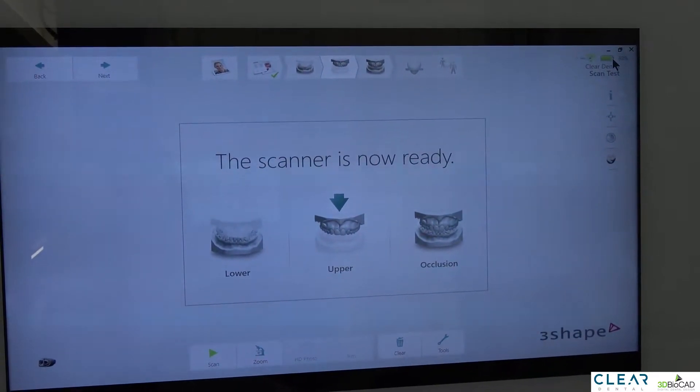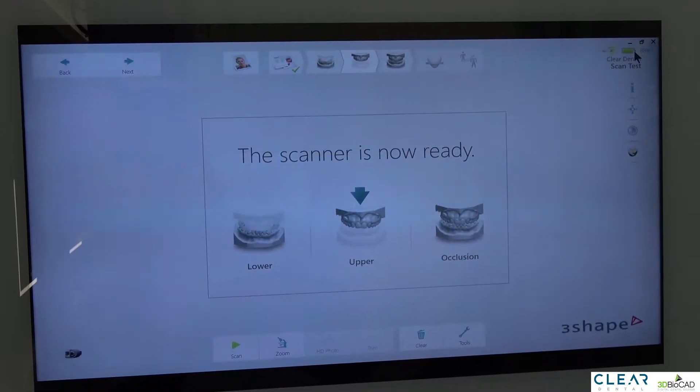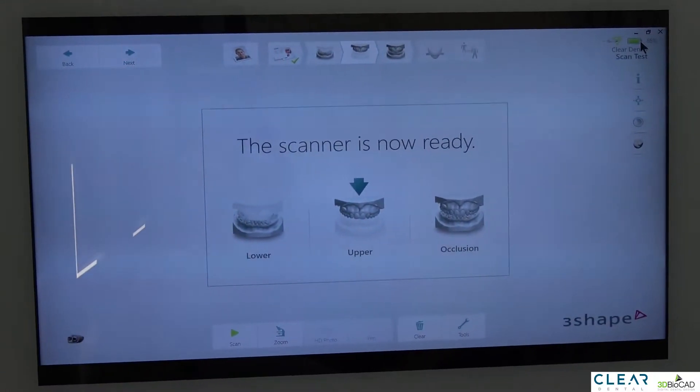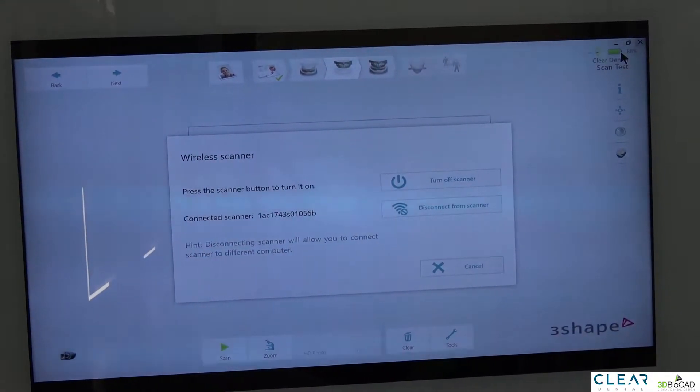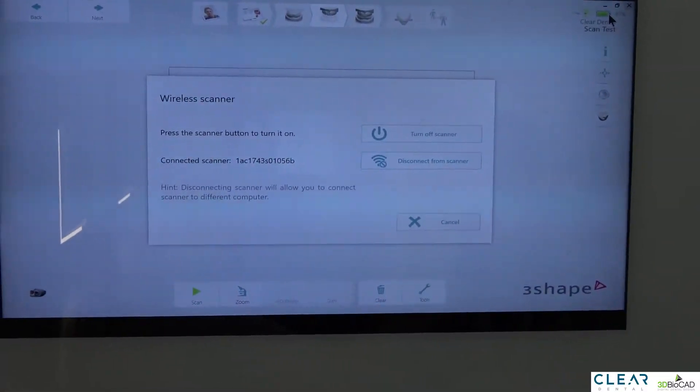One is for the battery life. The battery life, I feel like it's not that great — you can scan maybe two patients, maybe three if you're really fast. But the good thing is it does come with three batteries so you can recharge them as needed.